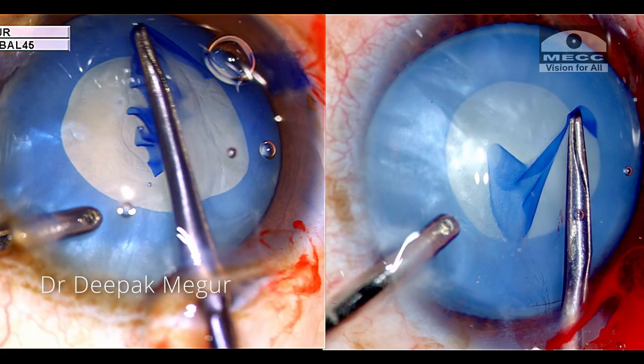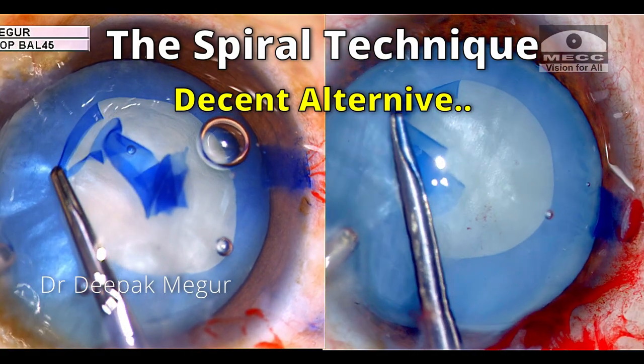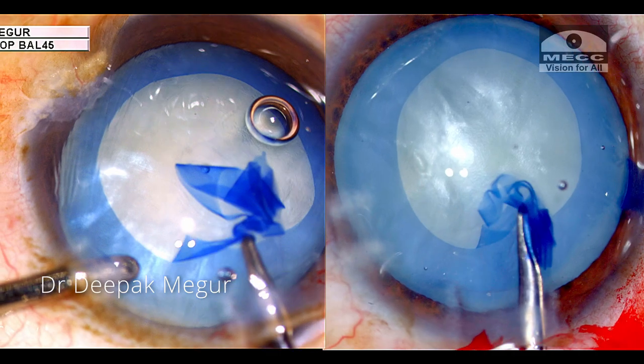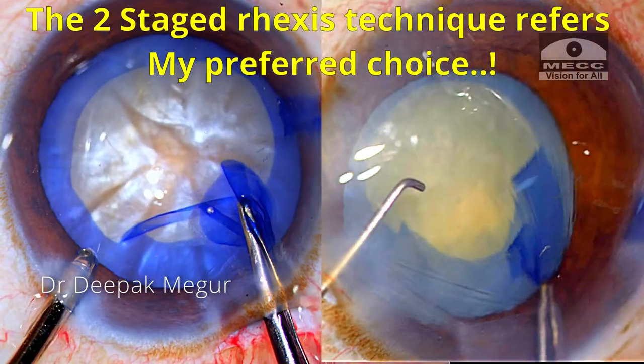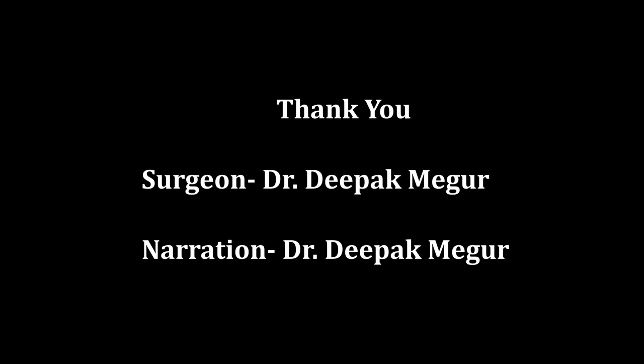To conclude, the spiral technique is an effective alternative to the two-stage rhexis technique when dealing with intumescent lenses. It is quicker but definitely not as predictable as the two-stage rhexis method. Hope you found this helpful. Thank you for your attention.